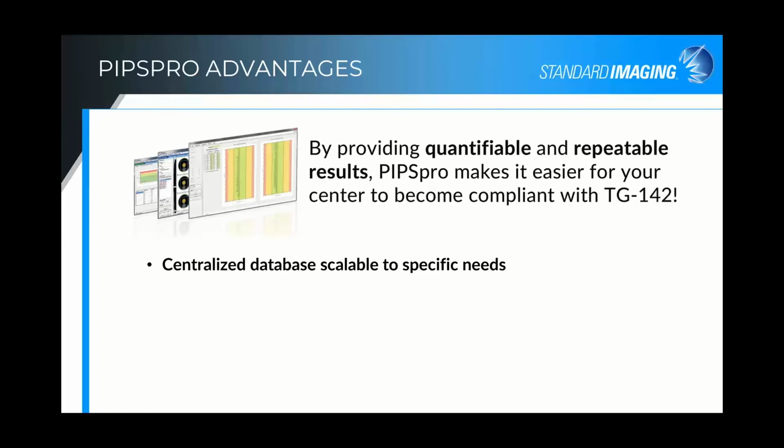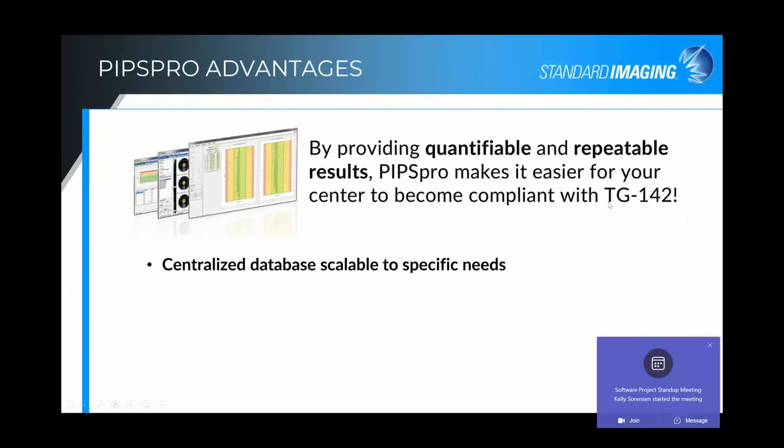Again, like I said, from the largest corporate situations all the way down to the smallest single LINAC, the single LINAC center as well.